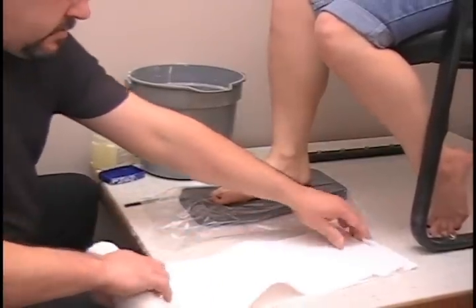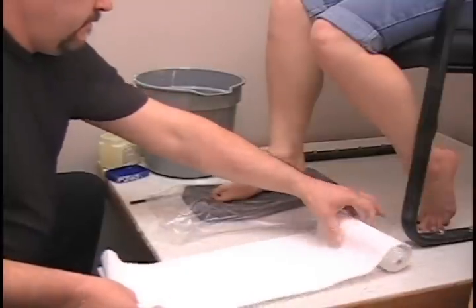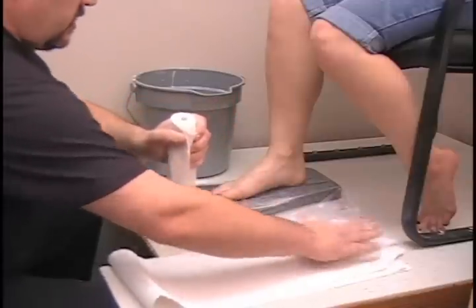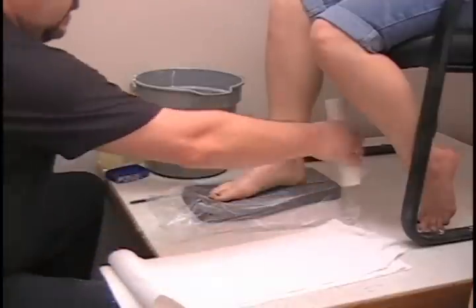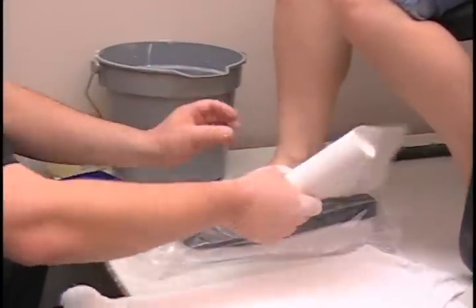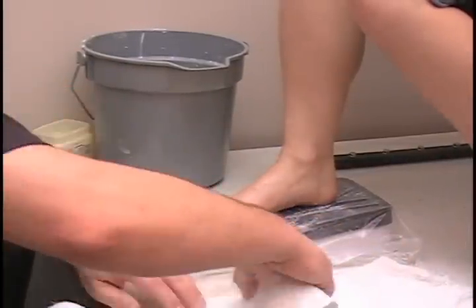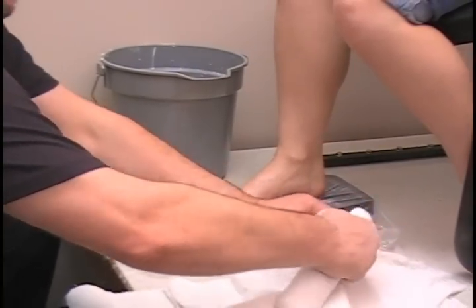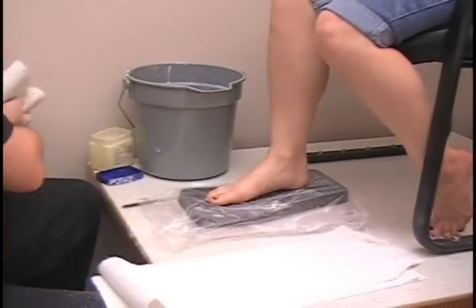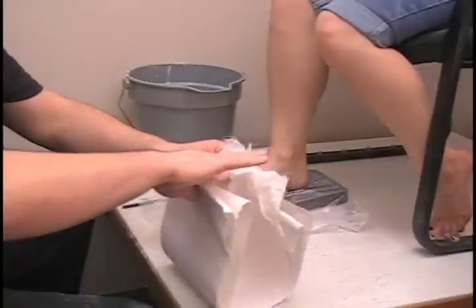We'll make four layers — one, two, three, and four — and then just rip it off. We are also going to want a piece for the back, going one inch on either side of the malleolus again, four layers. Set the front piece off to the side; we will use that in a few minutes. Take the back piece and put it in between your fingers so it is easier to unravel when you get it wet.